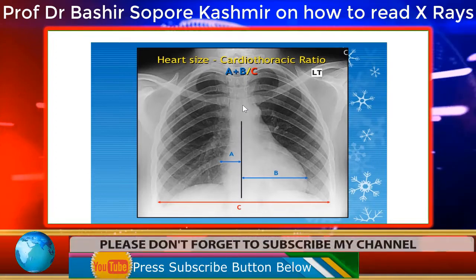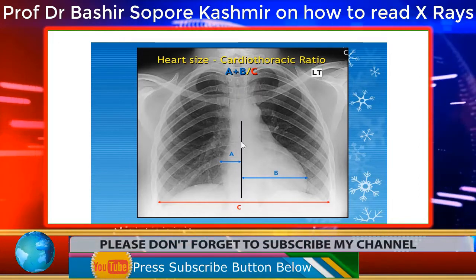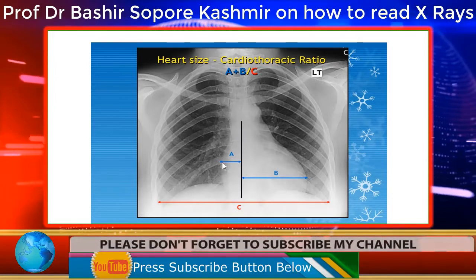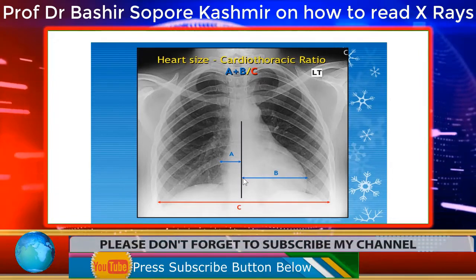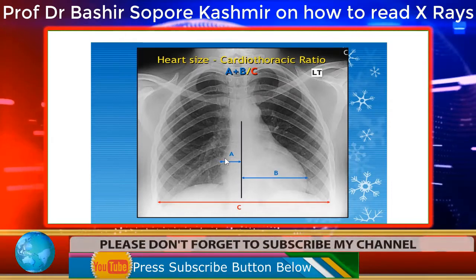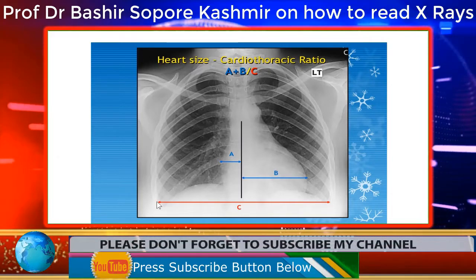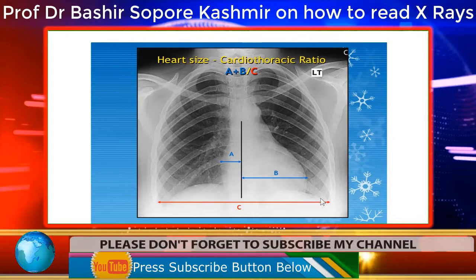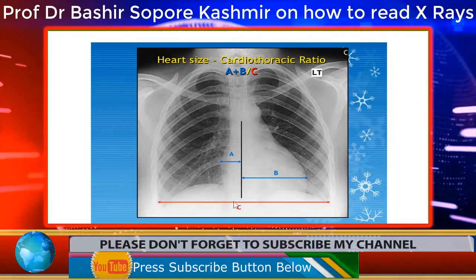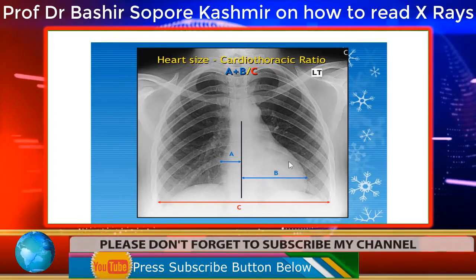Now, in this radiograph also, we take the midline vertically in the spine, then we measure the maximum distance from the right border of the heart. We also measure the maximum distance from the left border of the heart. We add these two, and then we take the transverse diameter at maximum distance across the chest wall, and we divide this distance by this distance. If it is less than 50%, it is normal. If it is more than 50%, then we say that the heart is enlarged.